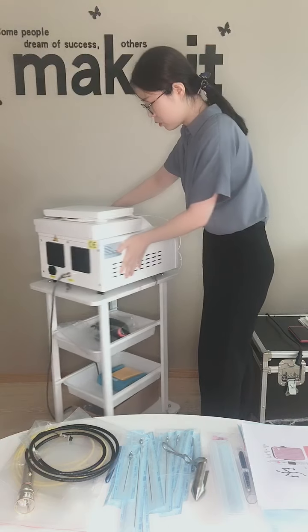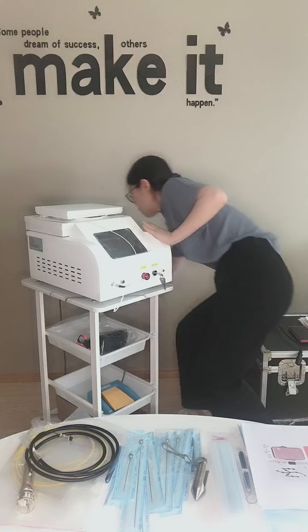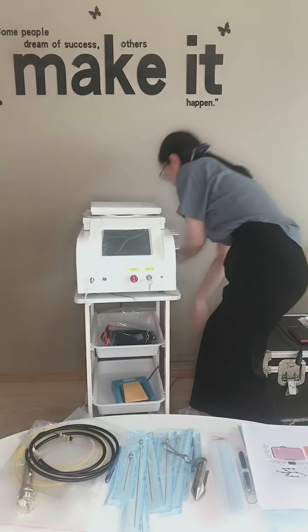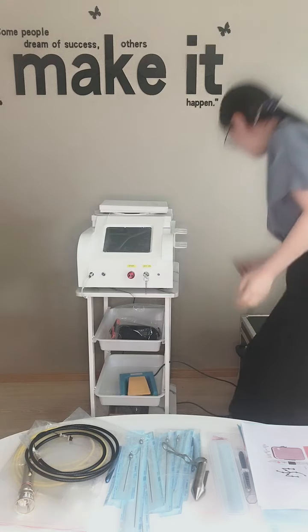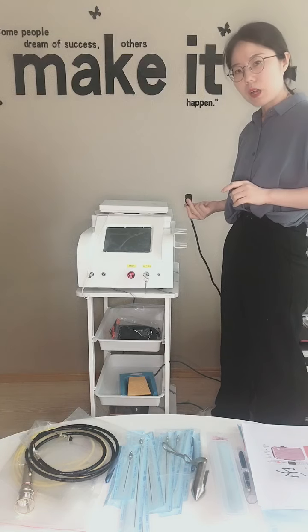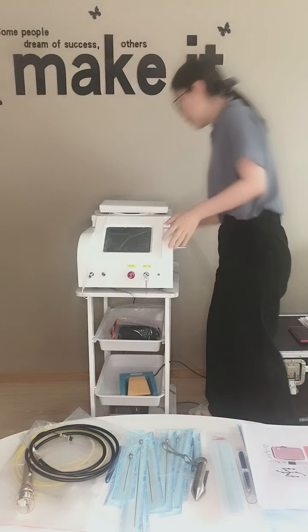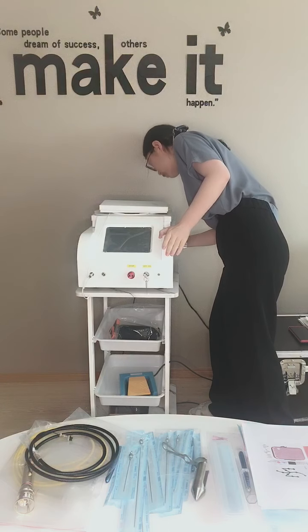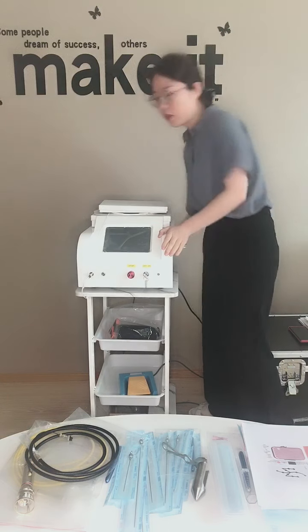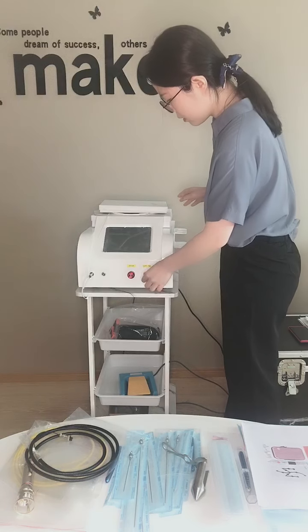And next, I will put the power line on the laser machine. For the power line in Europe, clients will use 220 volts. For American clients, we use 110 volts. So don't worry about details. And next, I will turn on the laser machine.